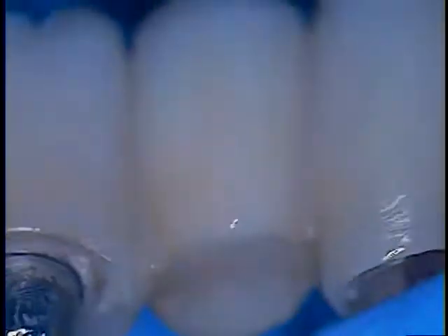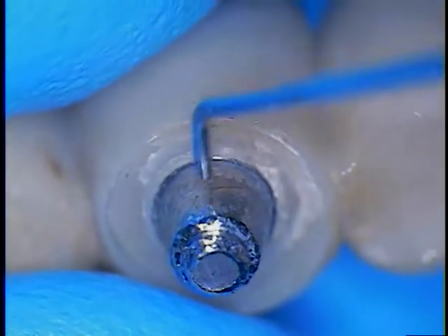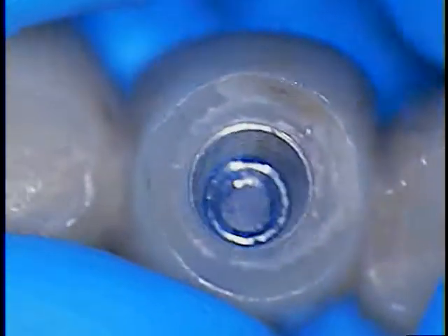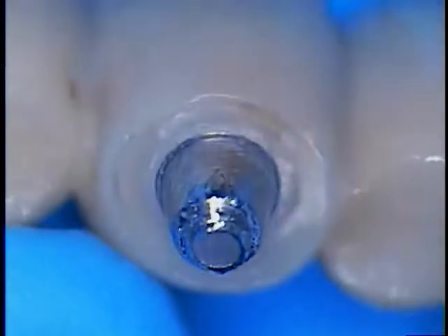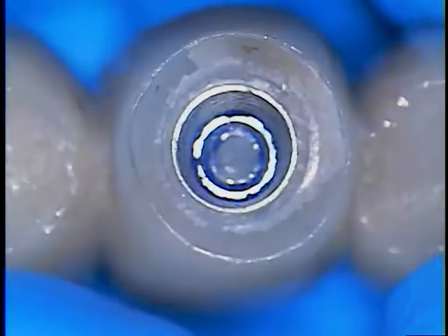The fragment is there. Whether the bridge can be used again is the next question. If this is in fact a standard abutment, it might be able to be retrofitted — minus the distal pontic — to help reduce the amount of force, and perhaps a bite guard considered as well. That's a lot of information. Let's take a look in the mouth.